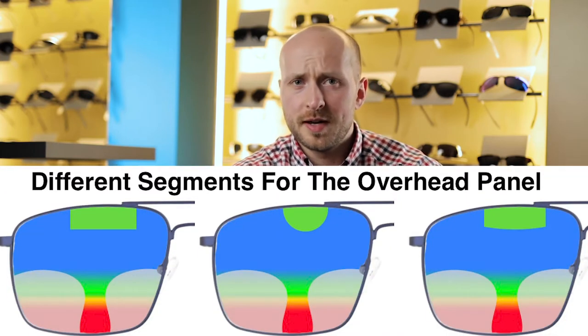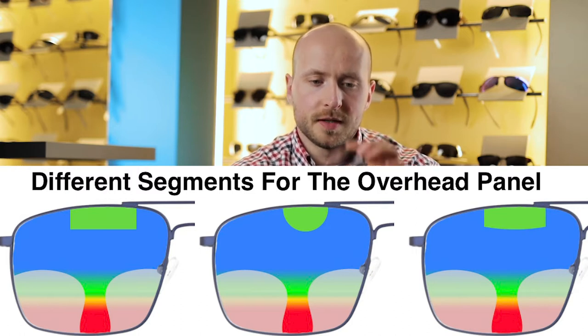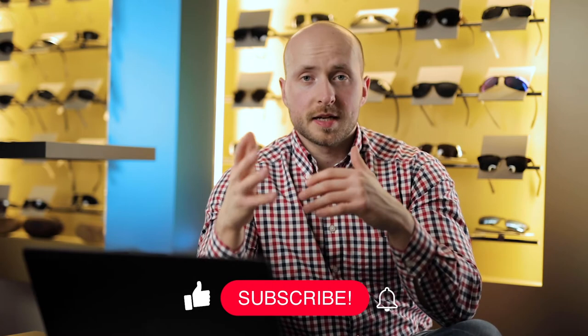Depending on your personal preferences for bifocal designs, you will get different bifocal lens segments and you can choose from different shapes — you can get them in a more rounded way or in a very straight way. If you prefer to get the segment size really big, you can have a lens design like a Franklin lens. When you add a lot of size to the bifocal lens design or to the rear segment, you will get a more clearly visible edge.